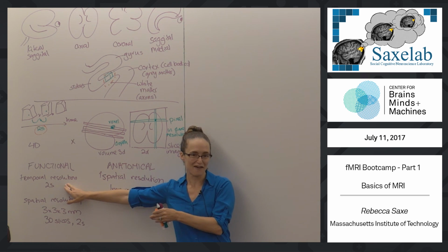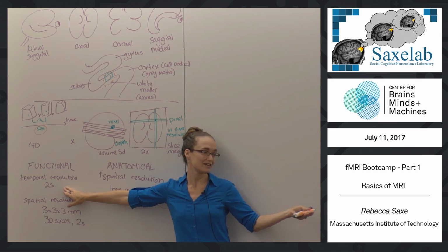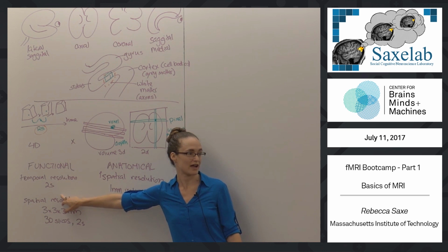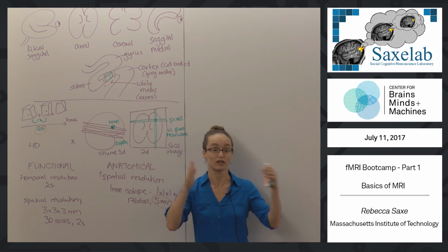Is this fast enough for anything, considering what we're trying to measure happens every 3 milliseconds? And should it be faster? And what would happen if it was faster? So we'll think about that as we go on to what's the signal that we're measuring. But it's definitely worth thinking about. You certainly could go faster. You certainly could go slower.